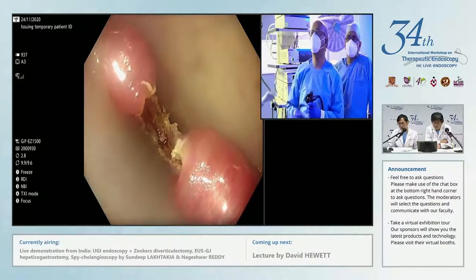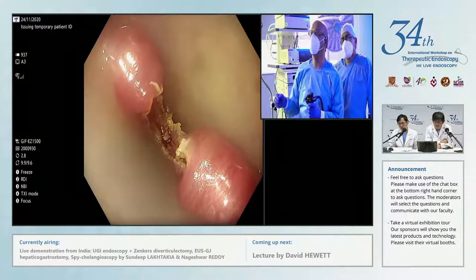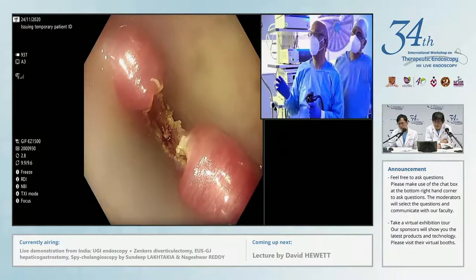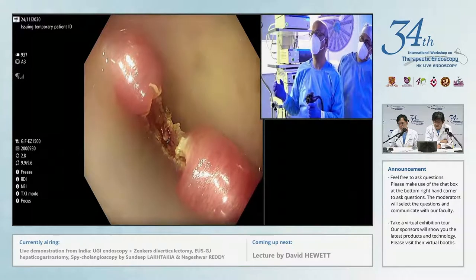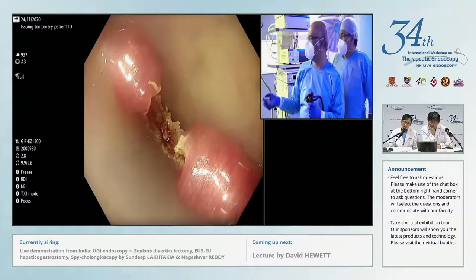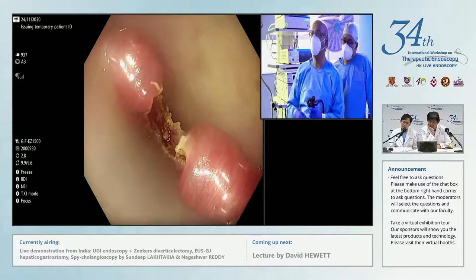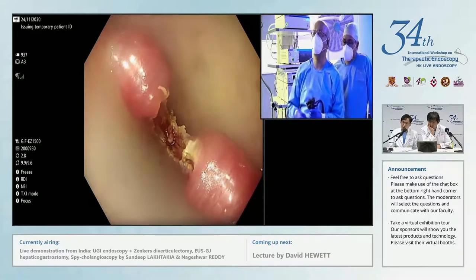Yeah, so the procedure is now, I'm going to put an Instinct clip to complete the procedure. The Instinct clip does two things. It closes this opening. Any small leak to the mediastinum is not a problem. And the second thing is that it increases the area of necrosis so that when it falls off, you'll find a much bigger opening than what you actually did.